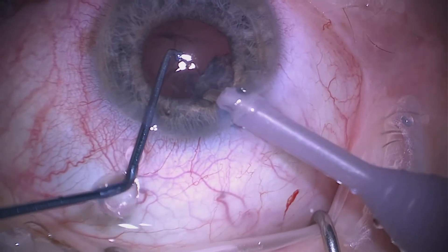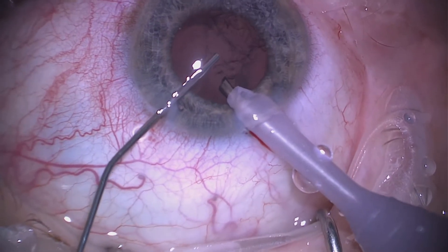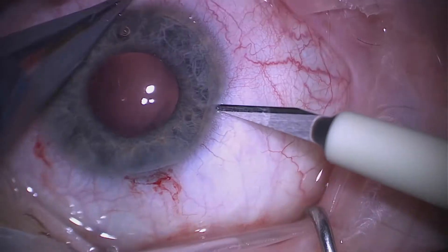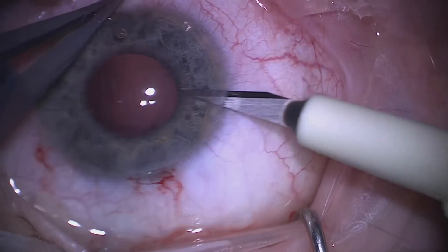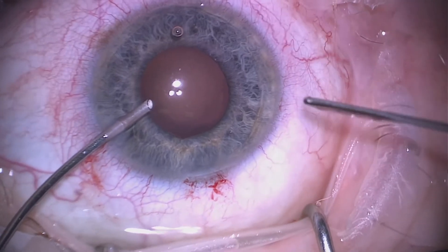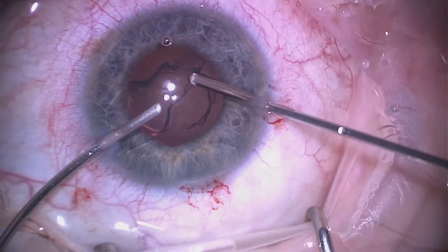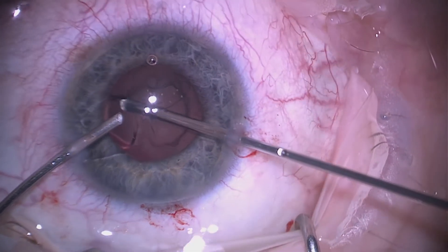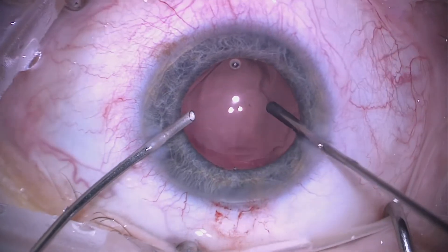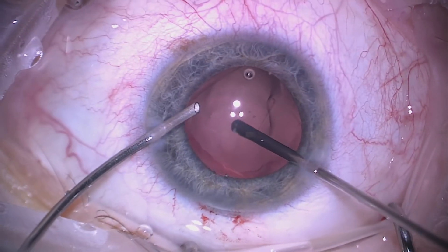This would cause traction on the retina. Once we remove the lens, we then place some more viscoelastic to tampon the anterior hyaloid face as we come out of the eye. We then need to do a decent core vitrectomy, as we're going to place a lens fixated to sclera. We're removing some of the Viscoat used previously and then carry out a thorough core vitrectomy.